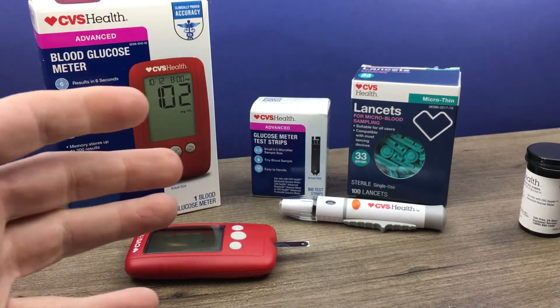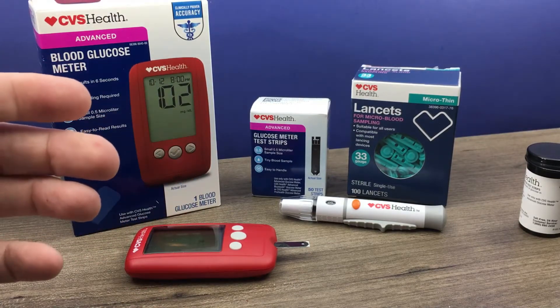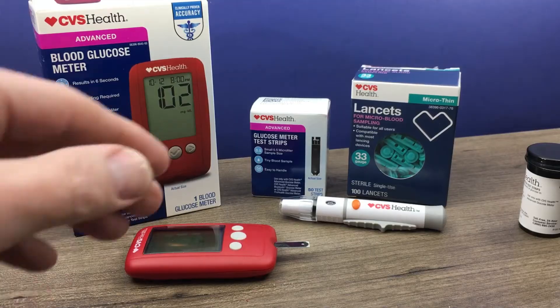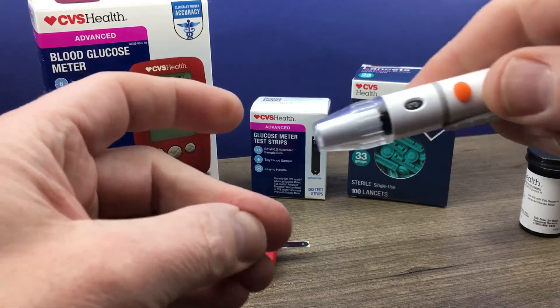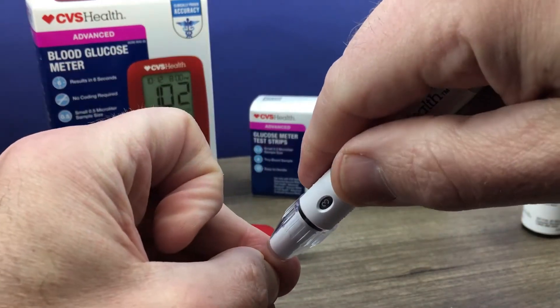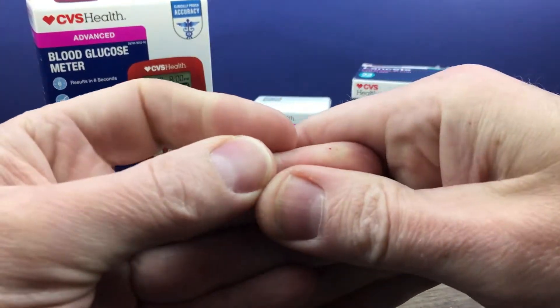You want to thoroughly wash your hands with warm soapy water and dry them. Then we will lance the finger that we're going to perform the test on — I prefer the side of the finger, right there.